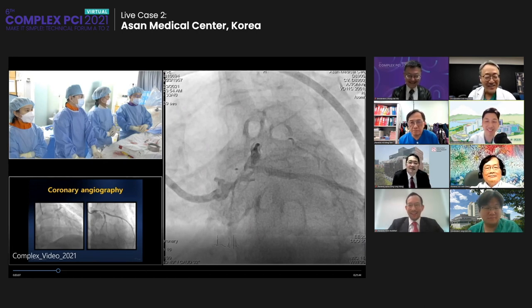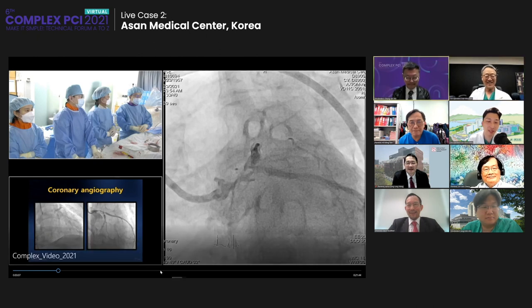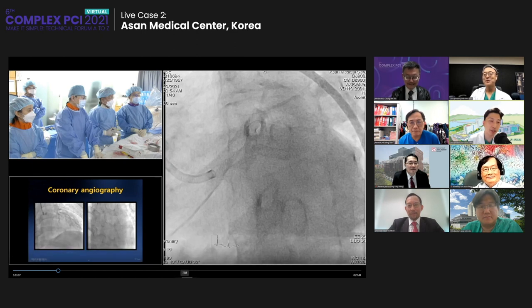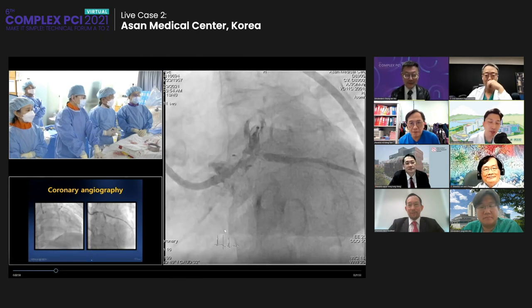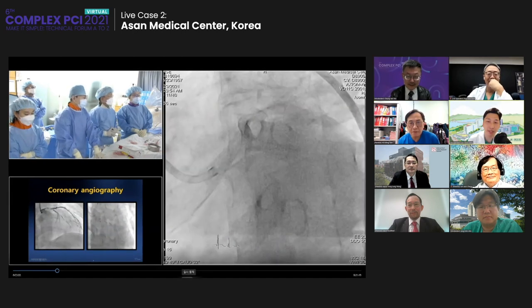People are starting the discussion, but that is not our routine. This is a specially prepared case. We also would consider bypass surgery. Yes, actually, this patient was recommended bypass surgery at first, but she refused. So we had to find another option. And we also told the patient that this is the last chance before the CABG.